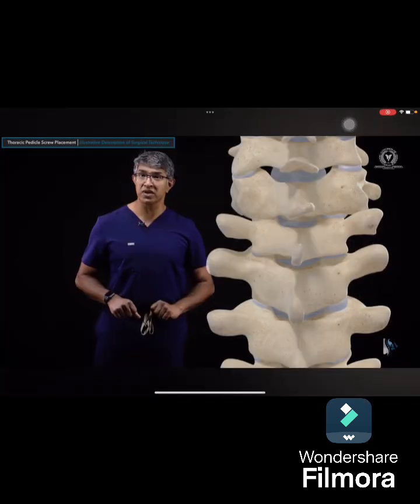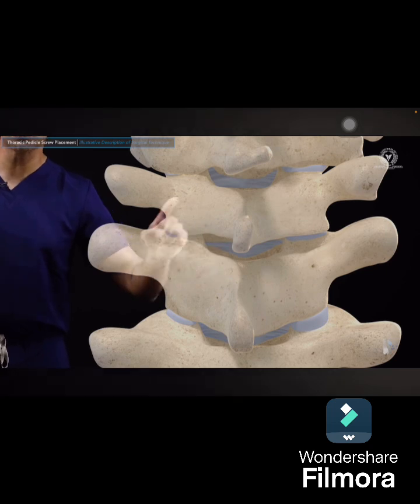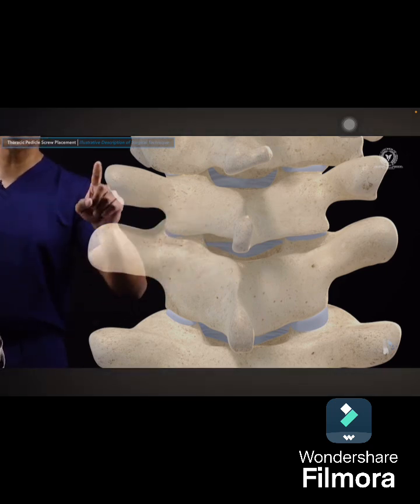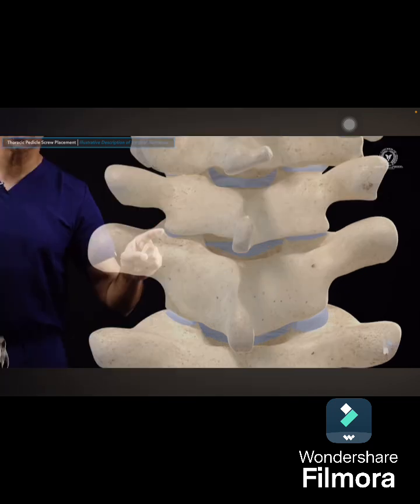If you've ever tried placing thoracic pedicle screws, here you can see the back of the spine, you can see the spinous process, here's the bottom of the lamina, the joint here between T1 and T2, and there's some important landmarks. Here's the transverse process, that's kind of unique in its geometry and its shape in the setting of the thoracic spine, and the pars right here. So this is the pars of T1.